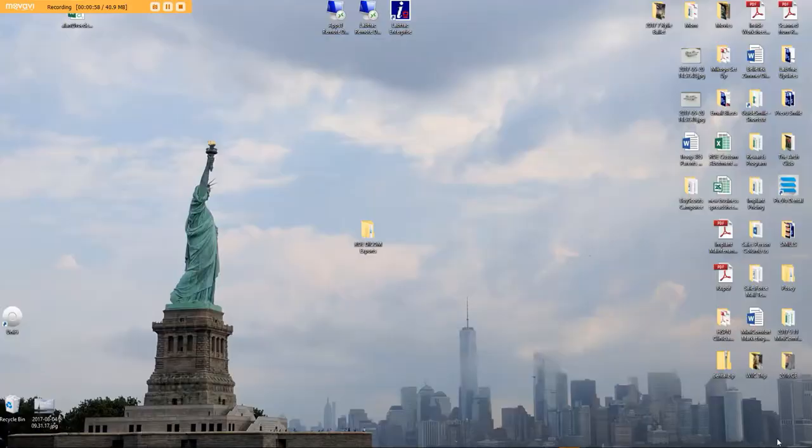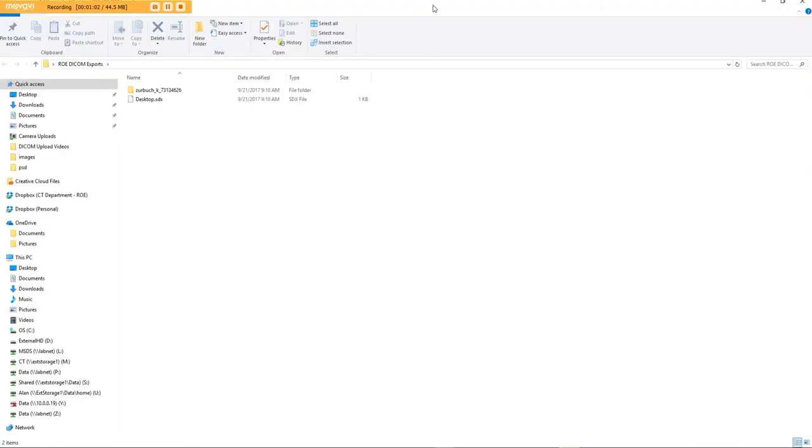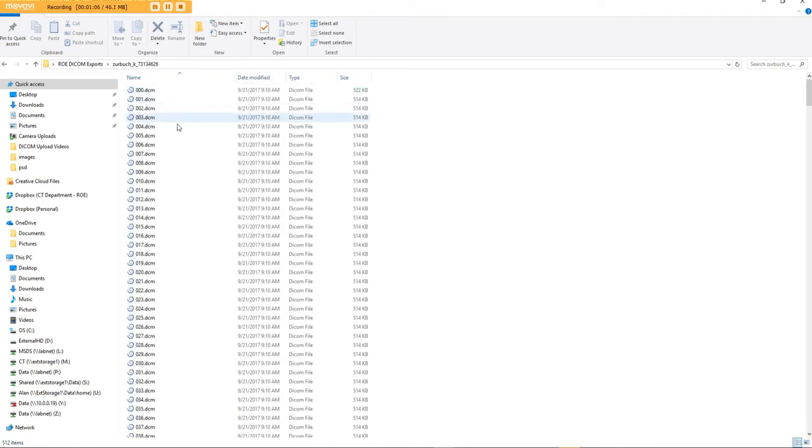So go to the desktop. Here's a folder I've already made, and I'll give you some more details of how I did that in a minute. Here's the patient, and this is what your folder will look like, full of DICOM files.